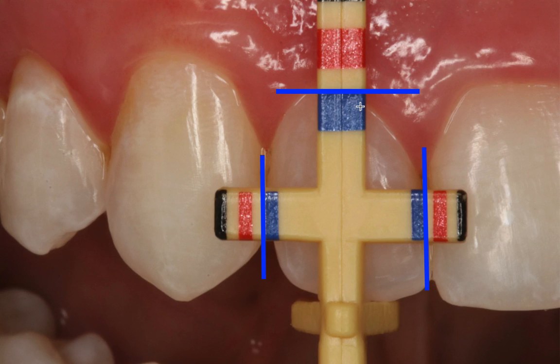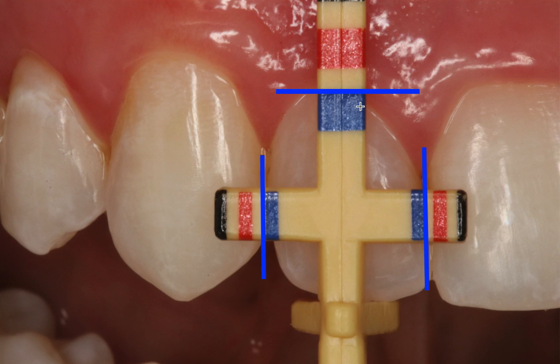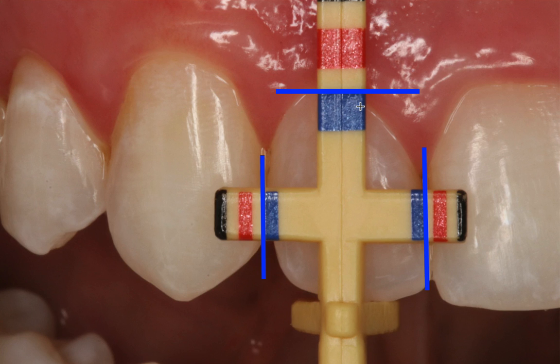My initial assessment was that this tooth is absolutely fine in terms of its proportion. And if we do some crown lengthening, what's going to happen is that we'll expose some of the root structure — some of the cementum and dentin — that will basically commit the patient to having a restoration on this tooth.